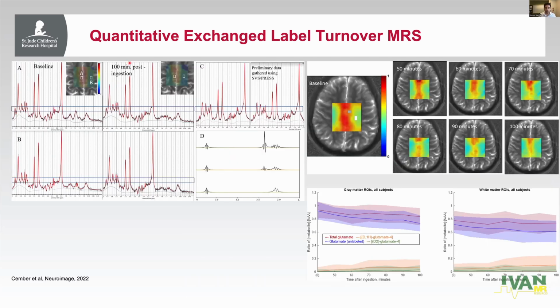So we thought that motion was a problem. We cannot do difference spectroscopy always, because there will be subtraction artifacts. So we thought we should train an LC model to incorporate the J coupling differences because of the labeling. So I'm assuming everybody knows what a glutamate signal looks like. It has 3 different peaks at 2.1, 2.4 and 3.7 ppm. This is coming from glutamate 4, which always gets labeled from the glucose that we are providing or drinking.